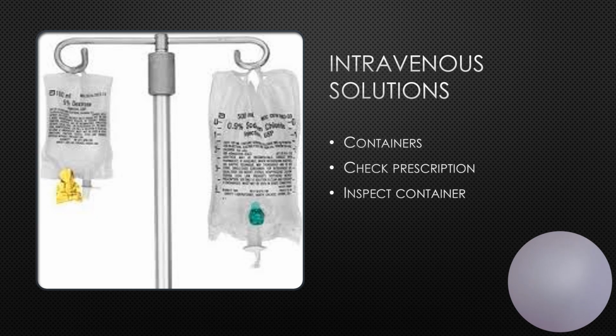A solution container should never hang longer than 24 hours due to the risk of bacterial growth. And understand that containers can come in a variety of sizes. 25 mLs to 1,000 mLs are going to be the most common.